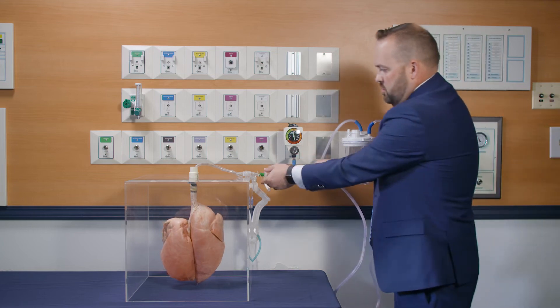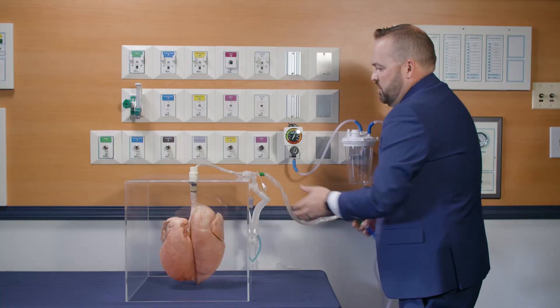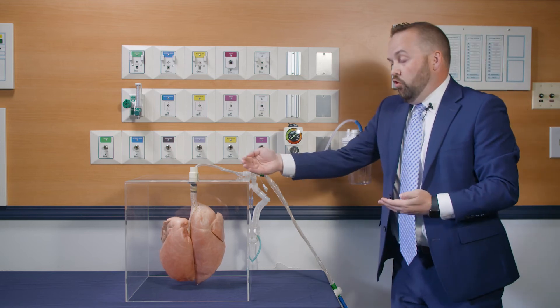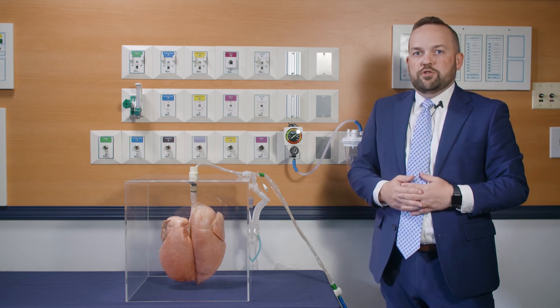So right now you can see the ventilator has a little bit more time to put more air into the lung as we're doing the procedure, rather than removing all of the air from there causing atelectasis, which is going to be much more effective at preventing those hazards from happening while we're doing that procedure.